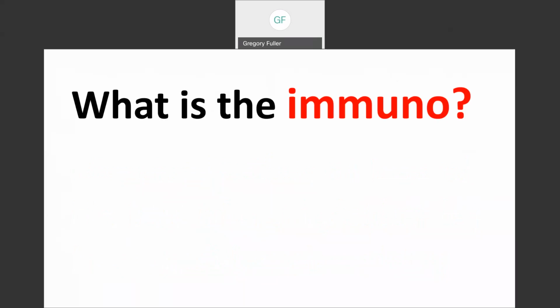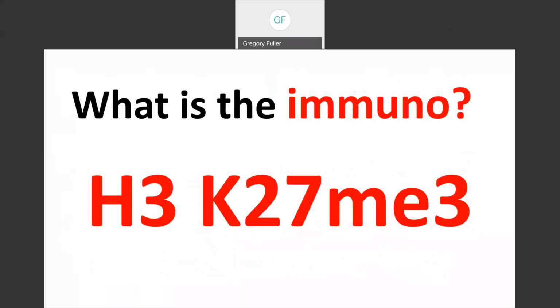All right, there is no K27M mutation in PFA ependymomas, but they do have loss of the trimethylation signature. What's the immuno? There it is, H3K27ME3. Again, if you only had a superficial knowledge of molecular signatures and you were to look at this and see, oh, H3K27, and you go brain dead and think, oh, that's a diffuse midline glioma. Oh, how bad would that be? That would exemplify everything that is wrong about many surgical pathologists, and I'm sure diagnostic radiologists.